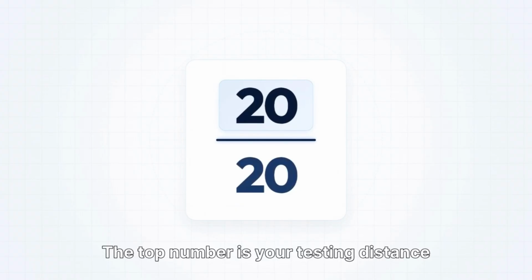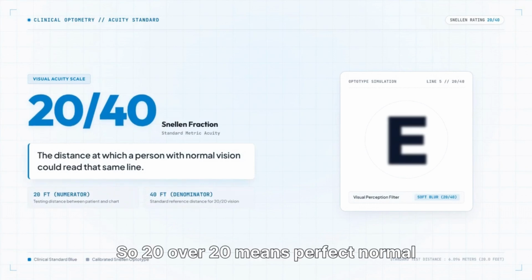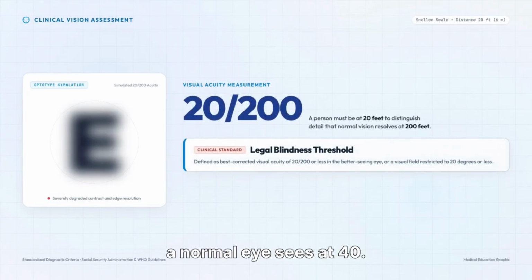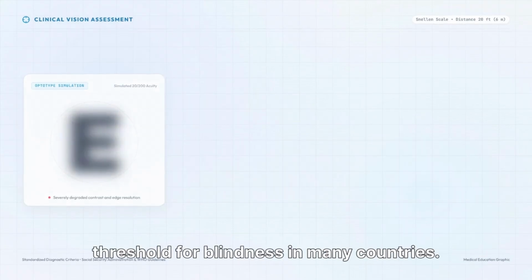The top number is your testing distance in feet. The bottom number is the distance at which a person with normal vision could read that same line. So 20 over 20 means perfect normal vision. 20 over 40 means you need to be at 20 feet to see what a normal eye sees at 40. And 20 over 200 is the legal threshold for blindness in many countries.